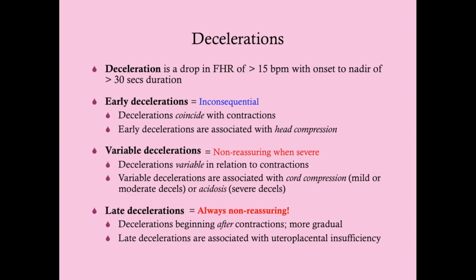You can vagally stimulate yourself and cause an early deceleration in yourself. Go rub your vagus nerve. It's going to reduce your heart rate. That's exactly what's happening in the baby. For this reason, it is inconsequential because it's a normal reaction to having something pressing on your vagus nerve. So yes, it's due to head compression, but it doesn't necessarily mean that there's anything wrong. Okay, so this is inconsequential.